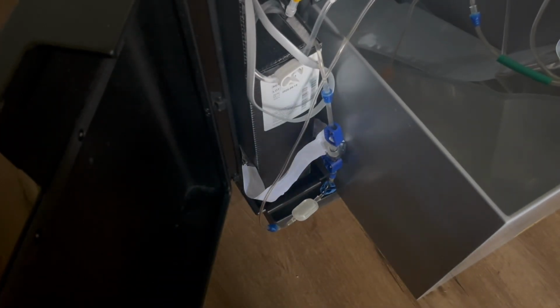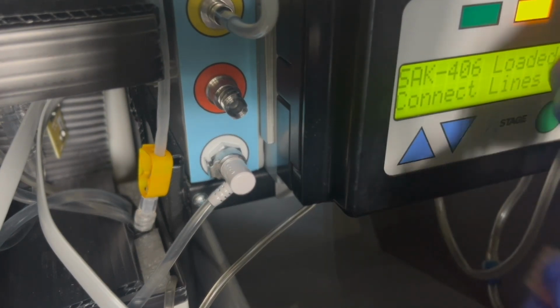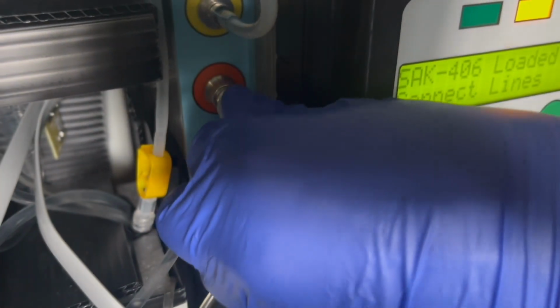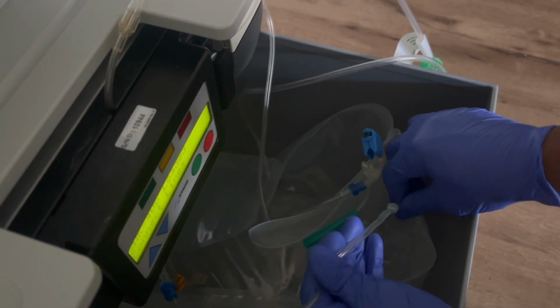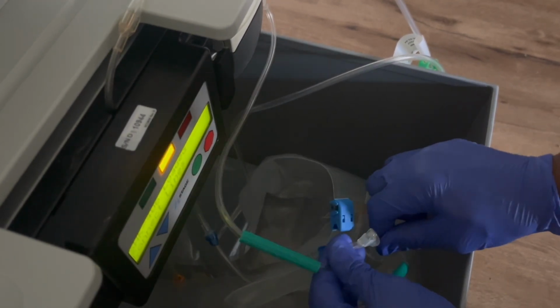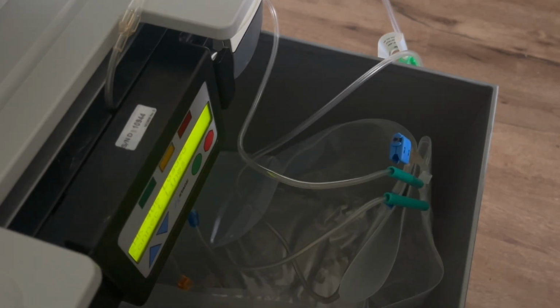All right, so after that's connected, the next thing you're going to move to is the orange tube with the top and the orange clamp in the center. So take that orange top off, as you see I'm about to do, and then connect it next to the control panel and secure it tightly. All right. The last thing we're going to worry about is the two tubes on the other side, the one that's connected to the pump and the ones that go straight into the control panel. Straighten the tubes out. It's going to pop those little rubber secure things, and pull the green tubes down over it to straighten it out so that the fluid can get in and out of the bag appropriately.